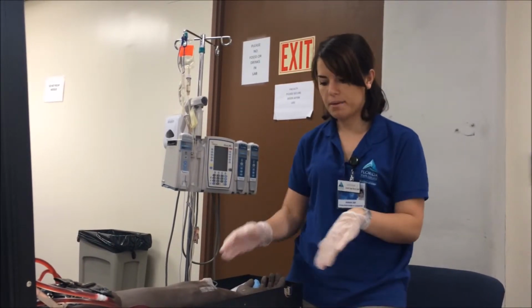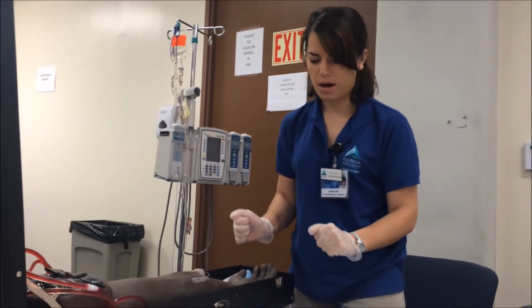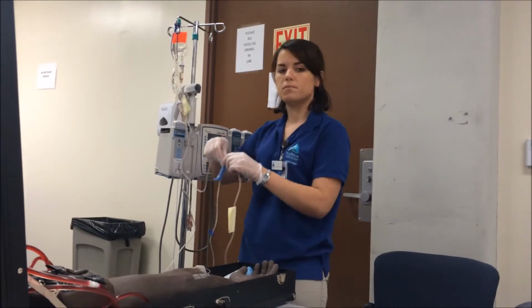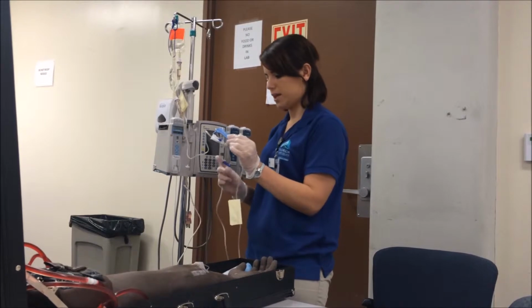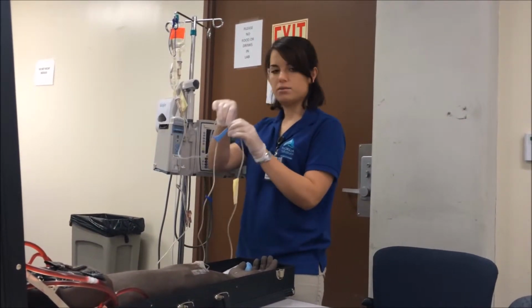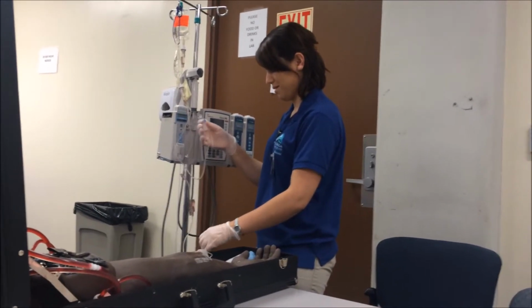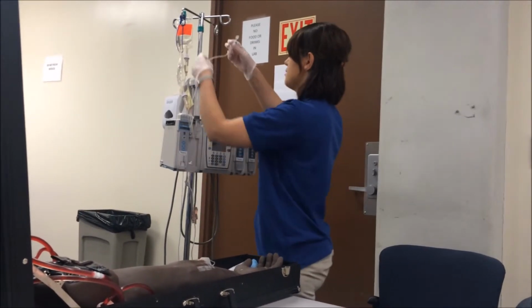Okay, I make sure to re-identify my patient so I still know I have the right patient. And then, since my medication is done, I will go ahead and clamp my mini bag. And I'll go ahead and unclamp everything in my primary, so I can let that now run. And I'll go ahead and remove my piggyback. At this time, I will make sure to put an alligator clamp on it and hang it for next administration.